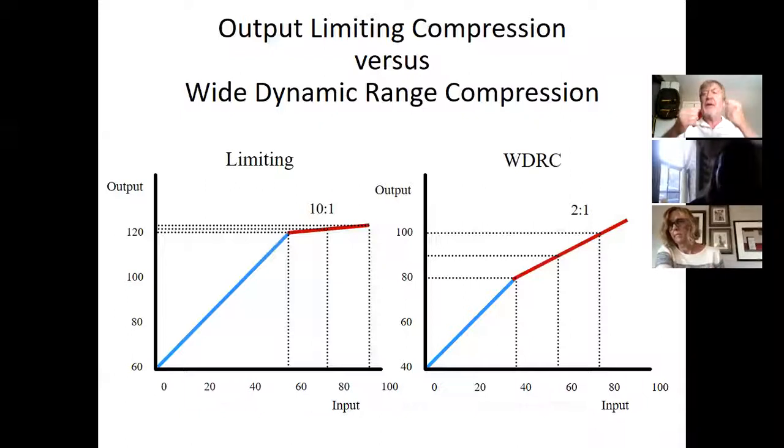So it was like me jumping up and down, hitting my head on a cement ceiling, because they wanted to limit the maximum power output, and by gum, they limited it. And then the first type of compression, output limiting compression. Look at how flat the line is. It's almost horizontal. Not quite, but almost horizontal. So in a way, this is a close first cousin of linear peak clipping. Linear peak clipping, the next one on the line, output limiting compression.